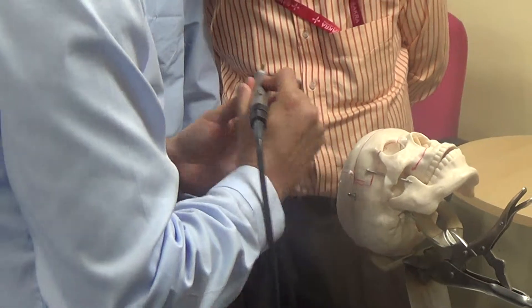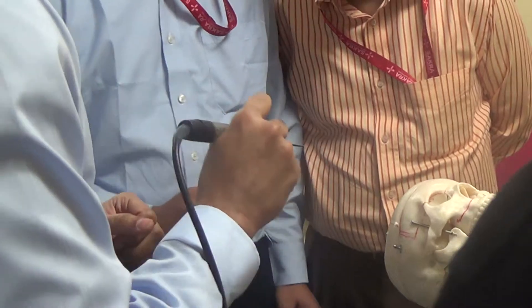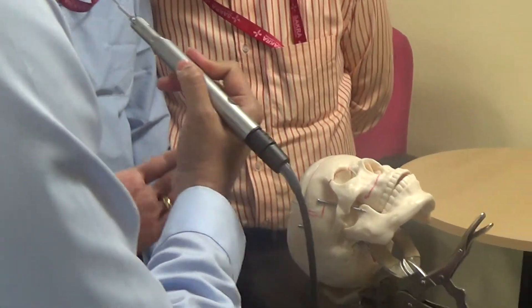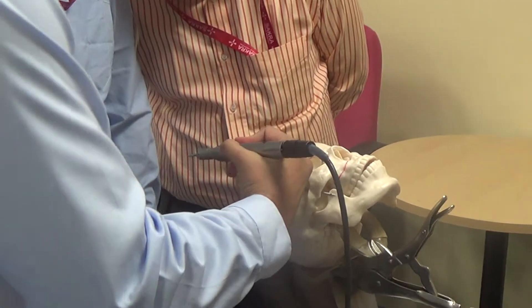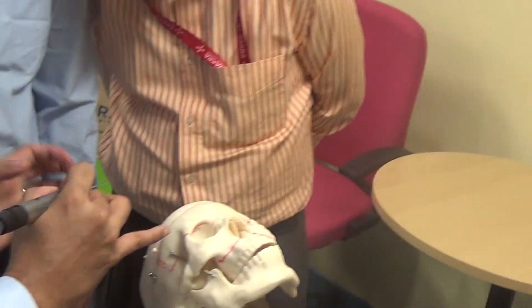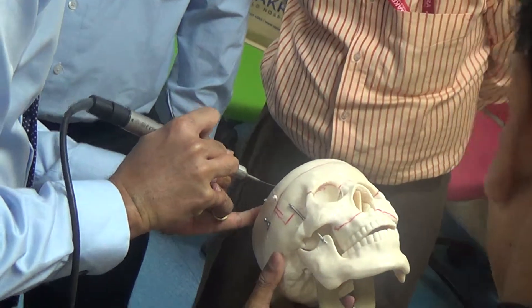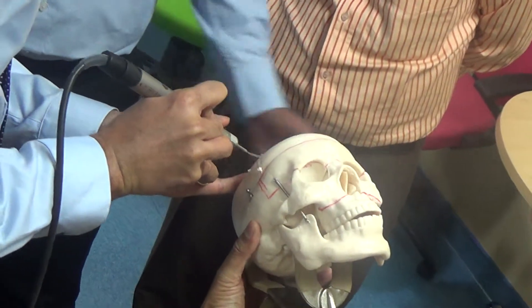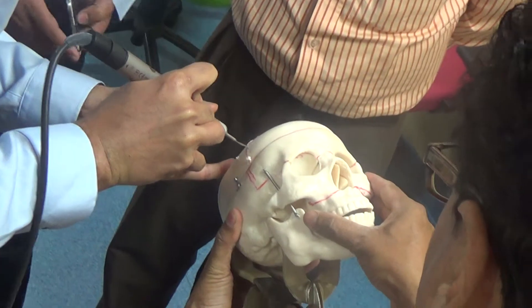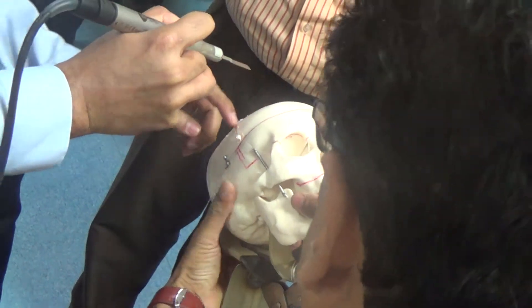Always, always support your hand. Never do this and suddenly go inside. Always maintain a stable surface like this. It's scalable — it's just standard safety.